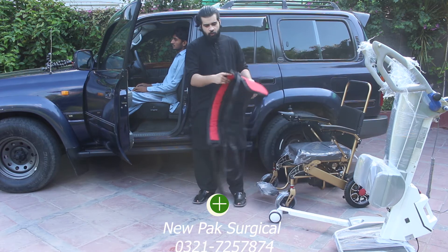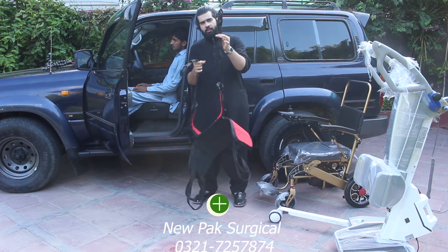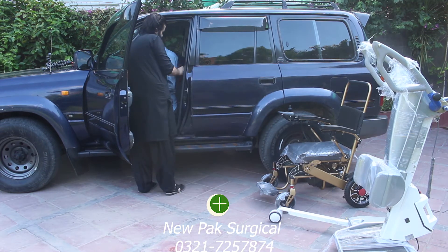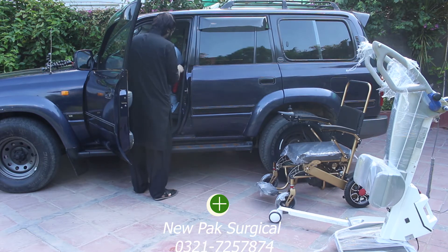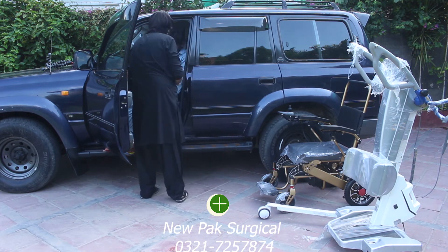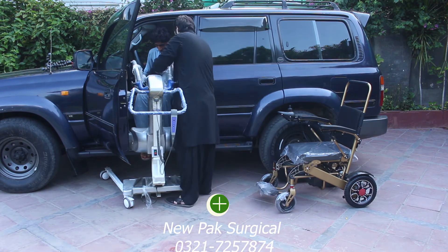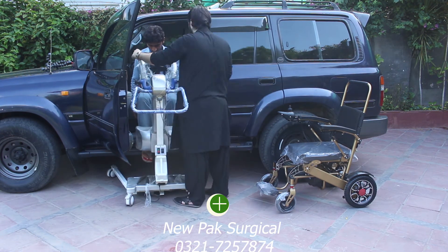Simply, you have to do the harness and strap it on your patient.